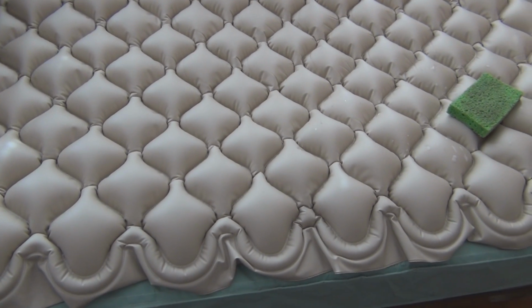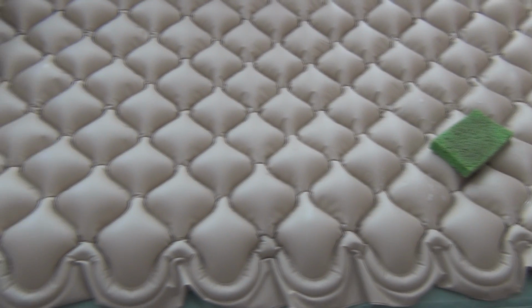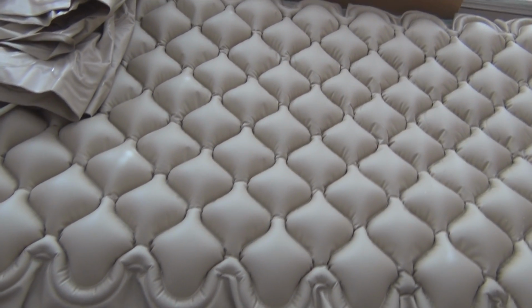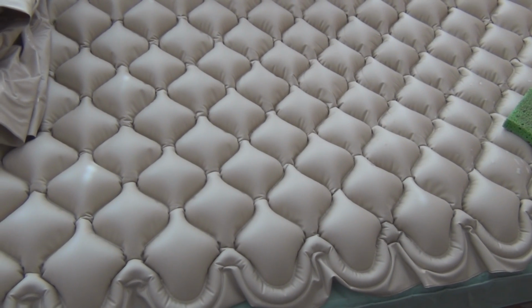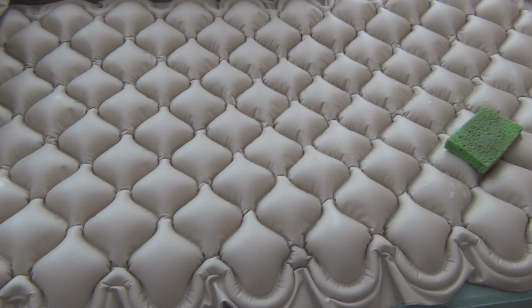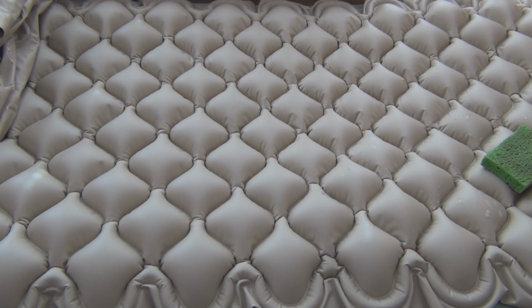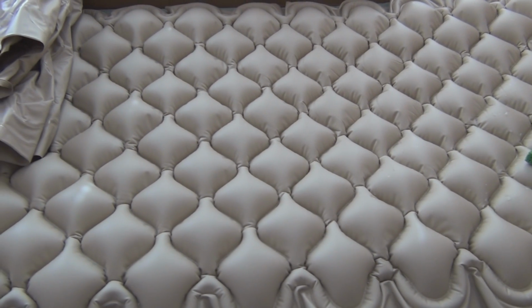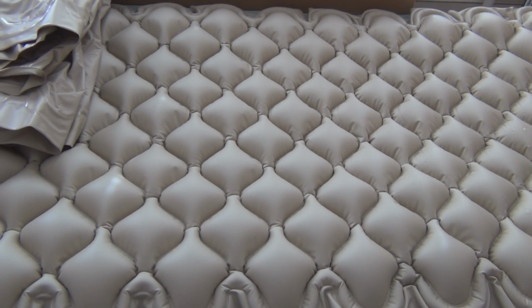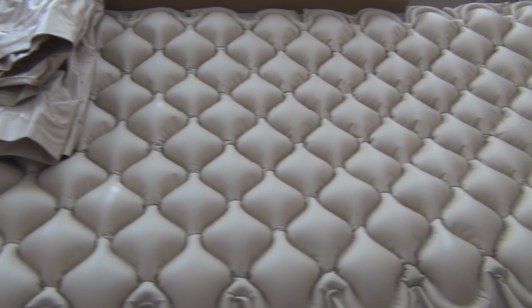This is an alternating pressure mattress and I'm getting ready to replace it because it sprung a leak. If you're taking care of someone that spends a lot of time in bed, it's really necessary to have one of these, especially if they have type 2 diabetes or full-blown diabetes, because you can get pressure ulcers or sores, and they can become really serious really quickly. The wound can just expand, and it almost feeds on itself.